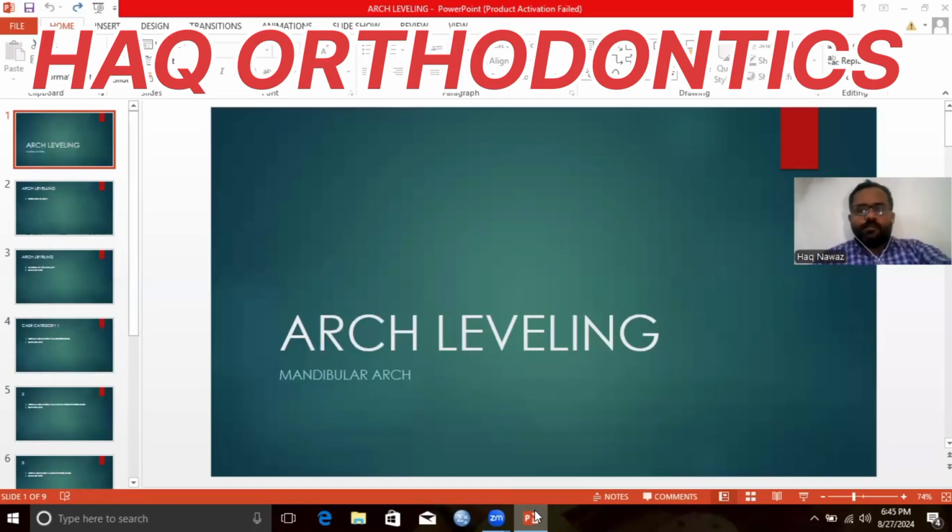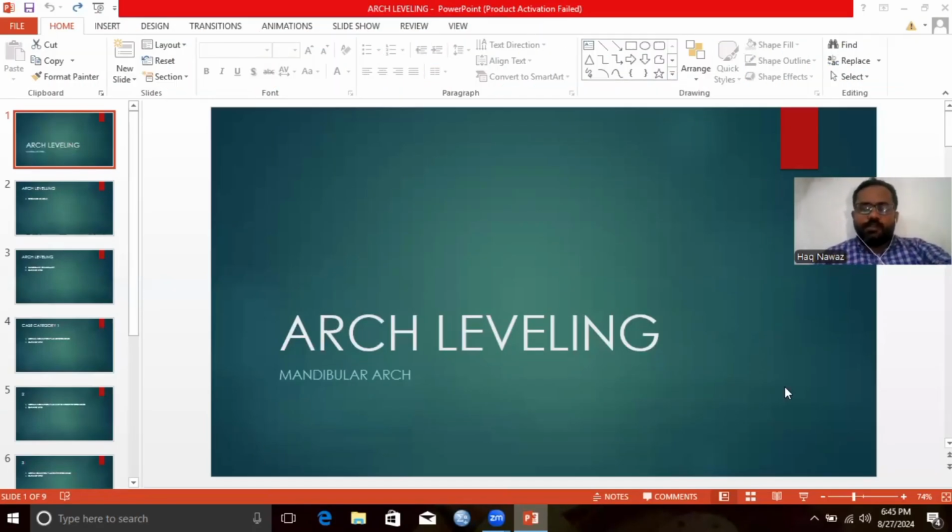Today we will learn about the vertical problems. A vertical problem can be due to the excessive eruption of maxillary incisors or due to the excessive eruption of mandibular incisors, which is easy to identify in the mandibular arch in the form of an excessive curve of Spee. Our main focus in this video is to resolve the vertical problem in the mandibular arch, which is basically arch leveling in the mandibular arch.